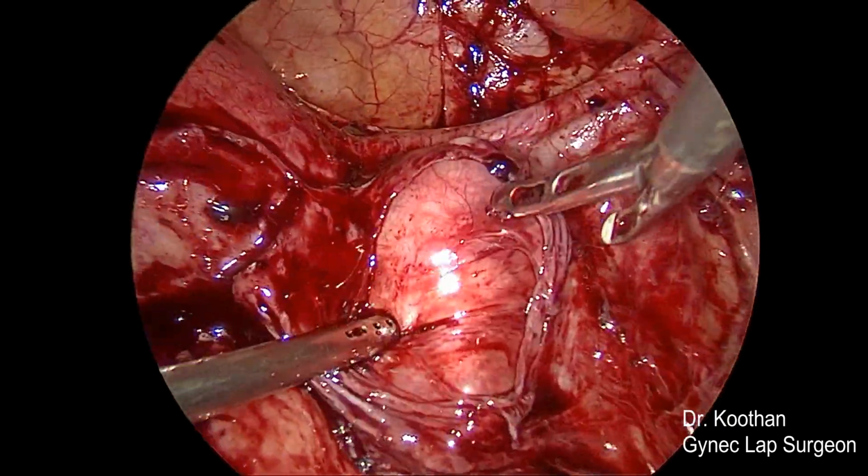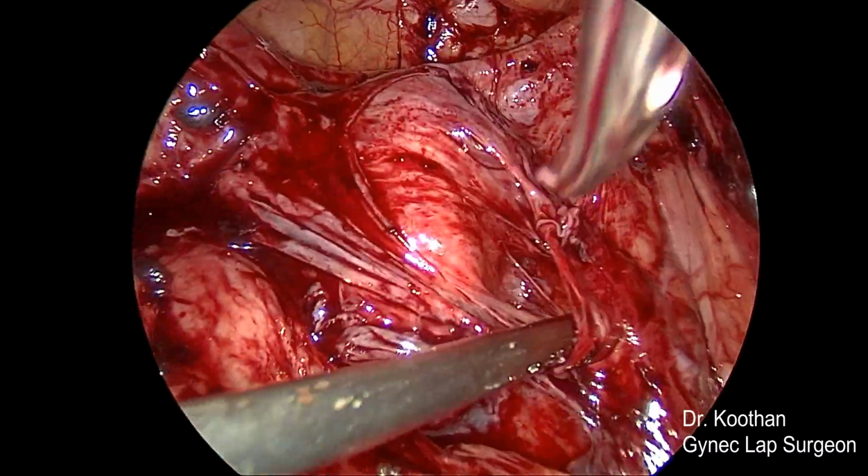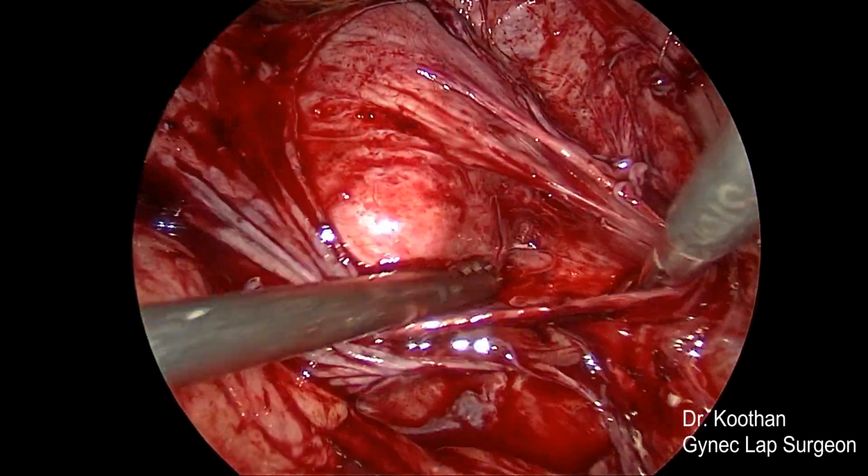Sometimes these cysts or this Pyosalpinx can be densely adherent to the great vessels of the lateral pelvic wall. We have to be very cautious.